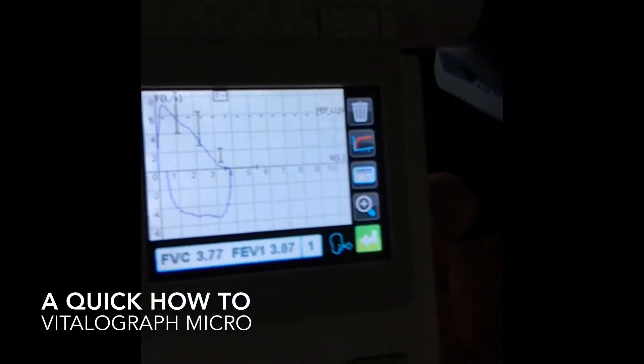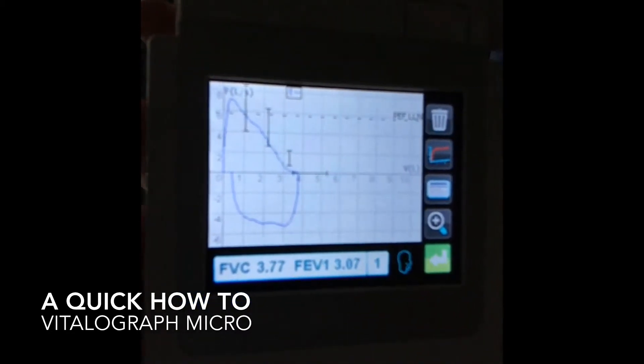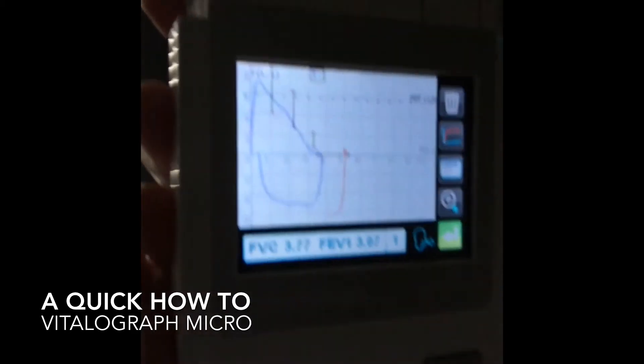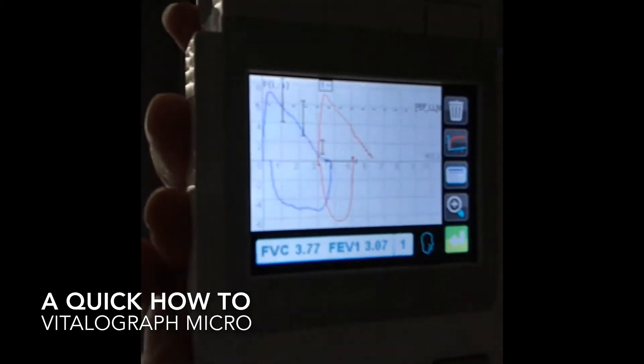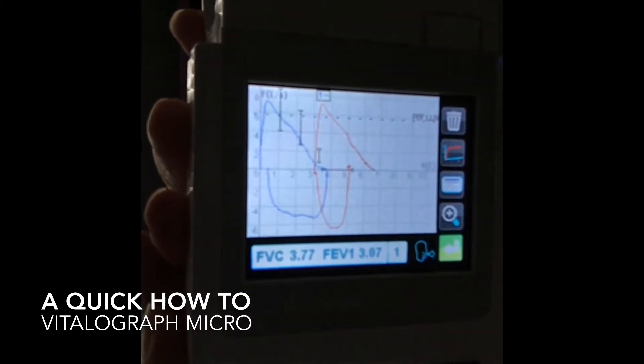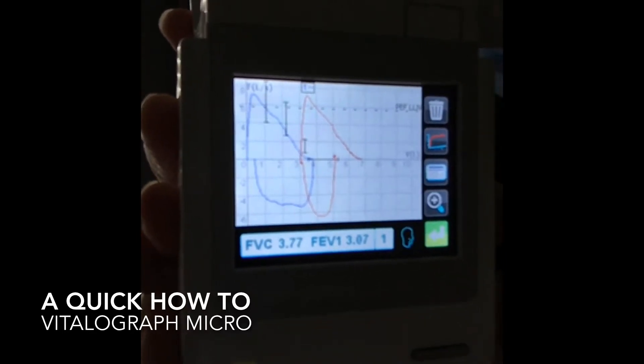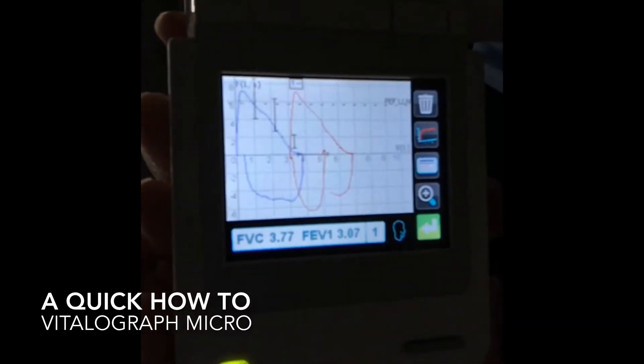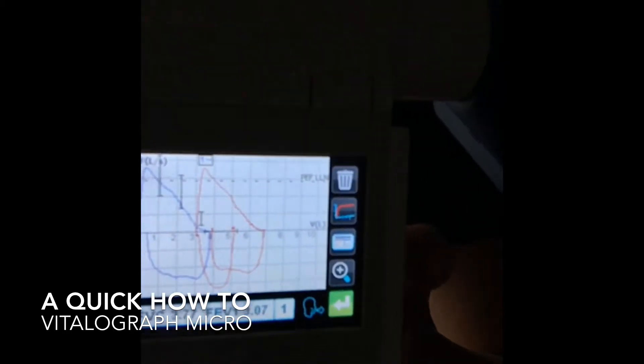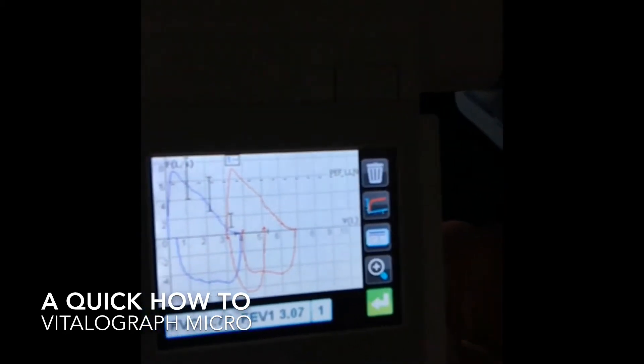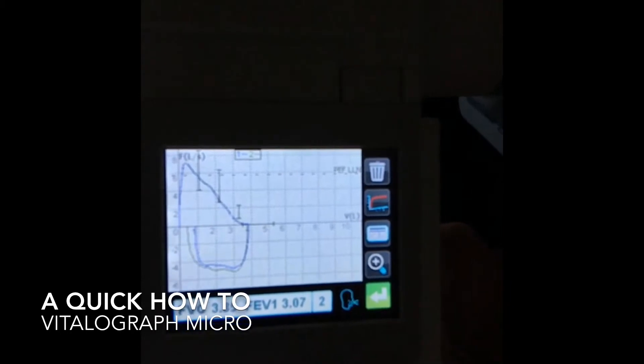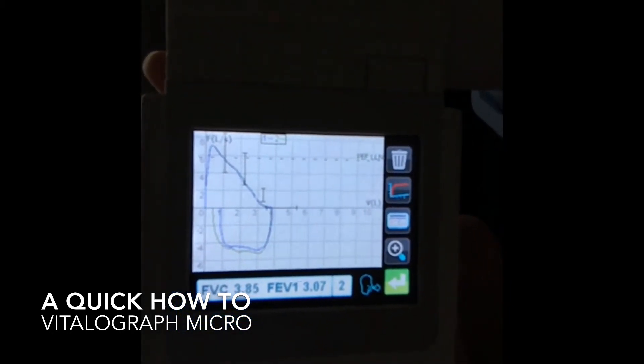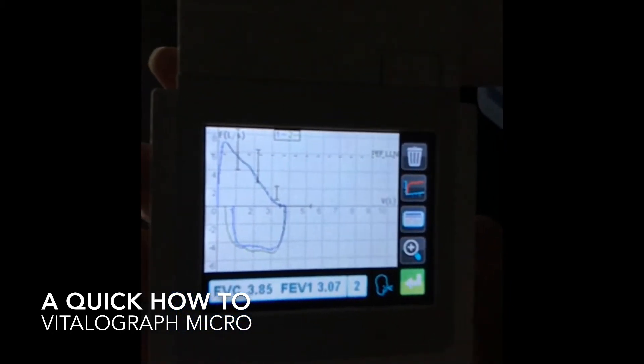When you see the little guy here in the bottom, there are no additional buttons to be pushed. Take a big, deep breath in. That finishes your loop. Great. We have number two. That's acceptable per our minimal ATS requirements.